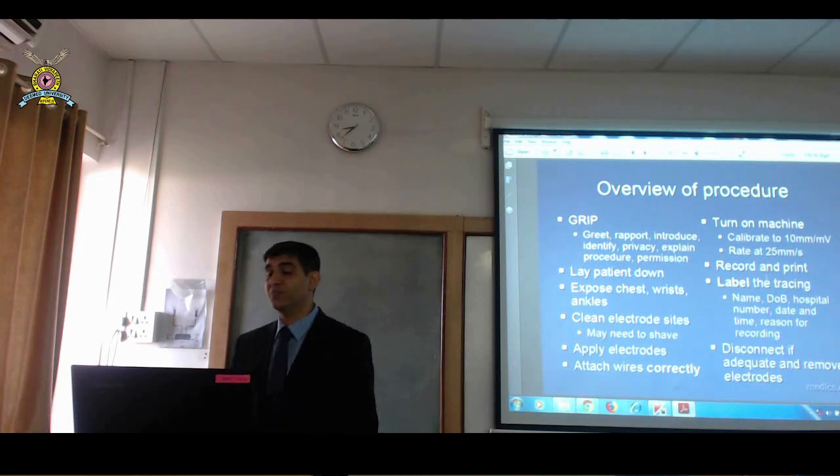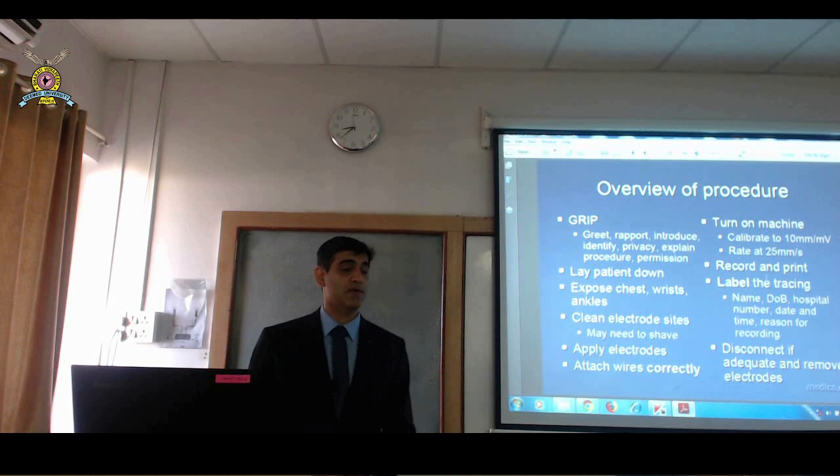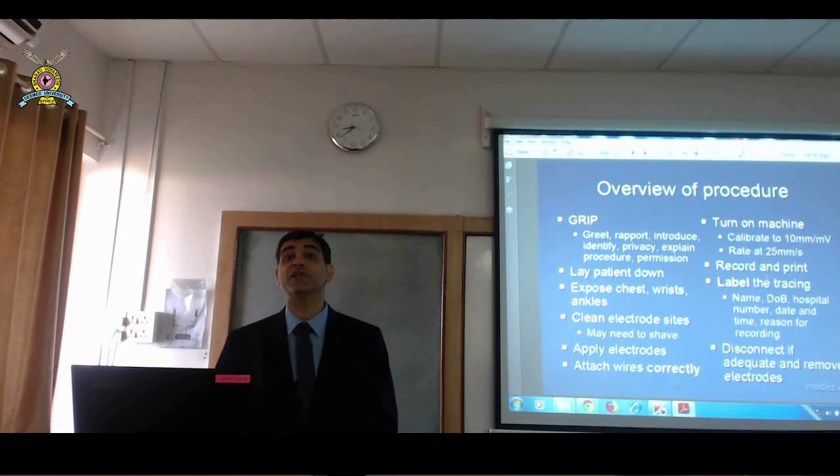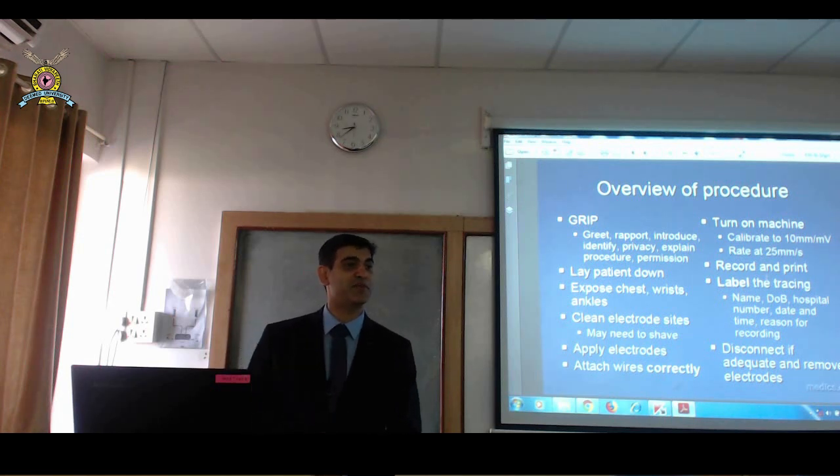Good machines: I would always recommend buying a good machine. A good machine means one from a standard company in the world. You've got small companies and you've got large corporations. Always buy from good, large corporations. The reason is I met some doctors who bought machines from non-standard companies, and I found that the ECG comes with automatic interpretation, and that interpretation is wrong if your company is a small company. Why? Because that company hasn't got the data and the skills and abilities to interpret the ECG. What happens then? You do an ECG, it comes up with acute inferior wall myocardial infarction, but actually there's no inferior wall myocardial infarction. Then you are worried because you're not an expert, you're worried whether there really is a myocardial infarction, and you call 10 people to find out.